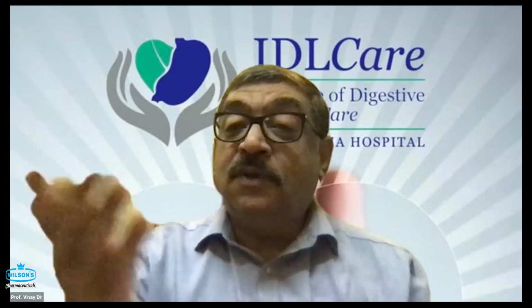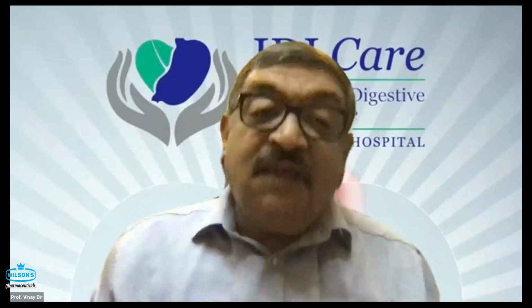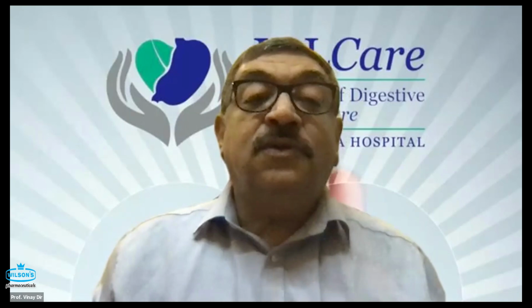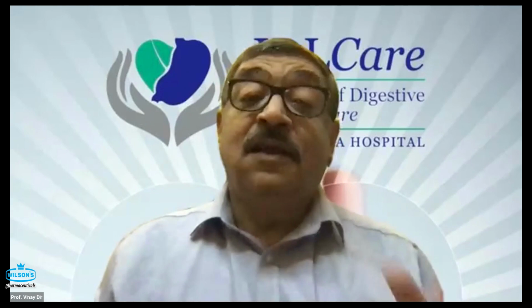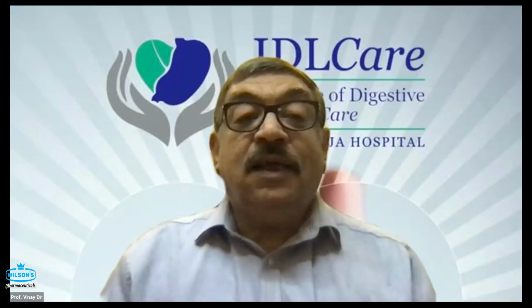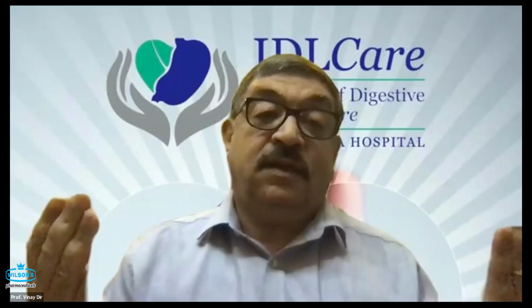Okay, so Khalid, study for you. I think for ERCP, we were joking. I believe ERCP is technically very, very challenging. And the primary reason is you are semi-blind when you're cannulating. So to learn to position your scope in such a way that your wire goes in the bile duct is quite a challenge. It's not easy. You have to have real imagination plus expertise of really small movements. So that way, puncturing the bile duct is no deal. I think if you compare one to one, learning EUSBD is easier than learning ERCP.